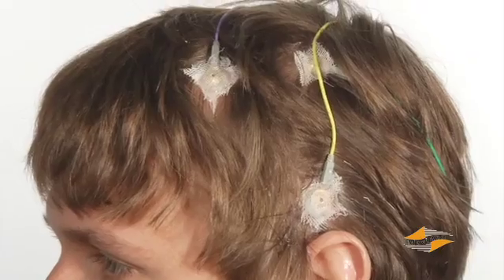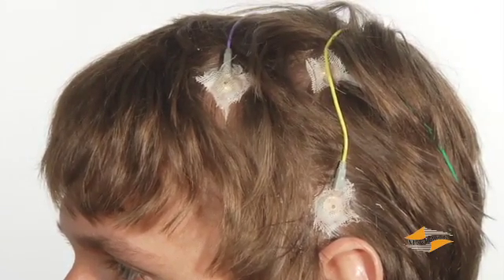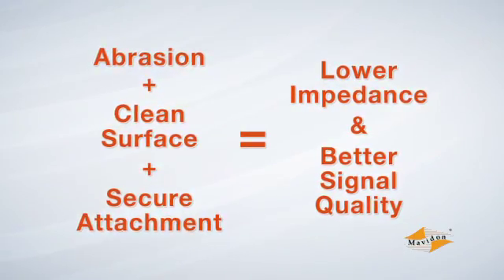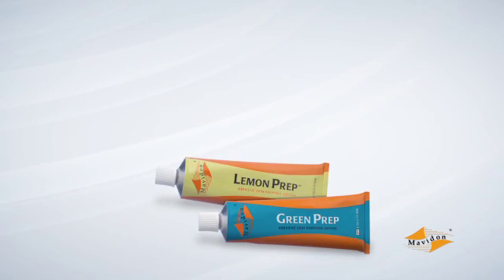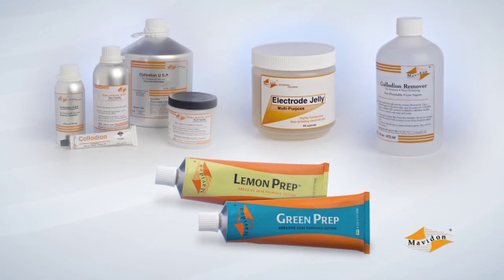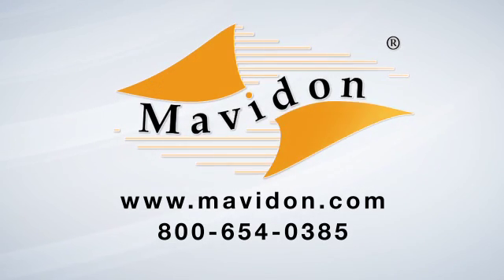Collodion can be a very effective means of securing electrodes for EEG and sleep testing. Remember: abrasion plus a clean surface plus secure attachment equals lower impedance. Using the proper application technique will help ensure accurate and useful recordings. Mavidon's Green and Lemon Prep, collodion, and collodion remover products help make testing easier for you and your patient. Contact Mavidon or your medical supply distributor for more information.